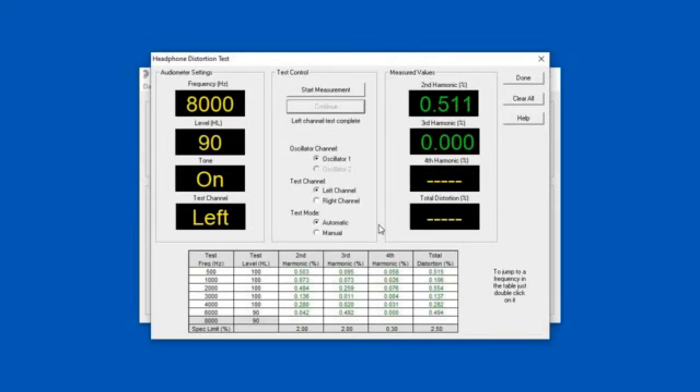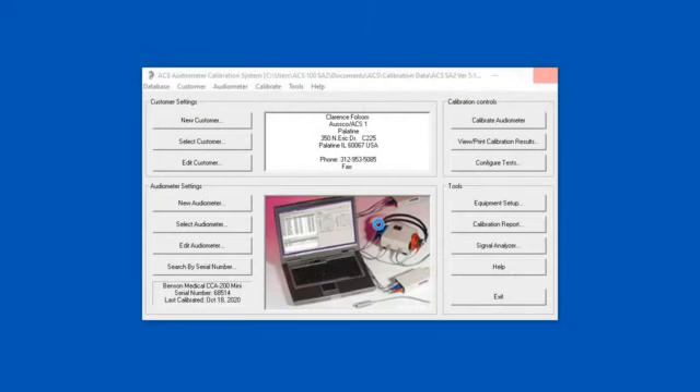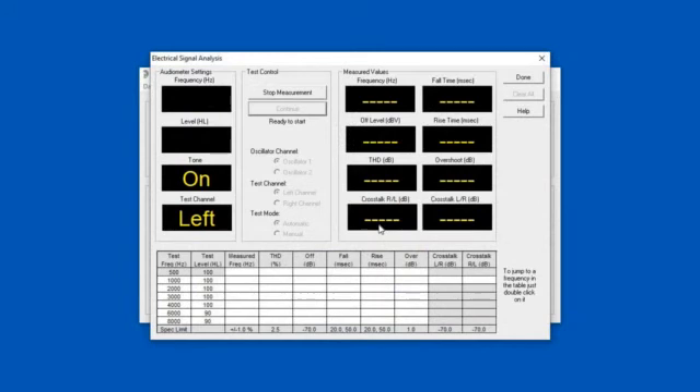We're done with the adjustment portion, and the rest of it is the analysis. Here's at 500 Hz, simply going up — frequency is 500, intensity is 100 dB, tone is on, in the left ear. It's changed to 1K frequency, still at 100 dB. You're going to see something now — it turned it off because it wants to see the rise and the fall. And if you've noticed down here, it's done the crosstalk over into the right ear, coming back in and now checking the crosstalk in the left ear.